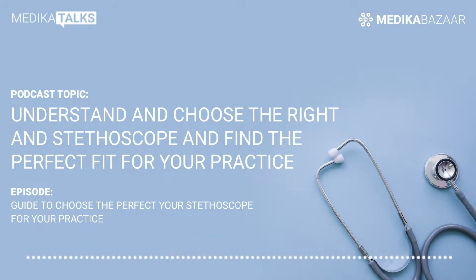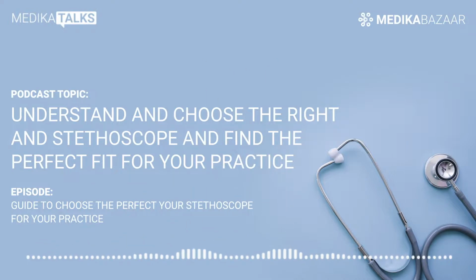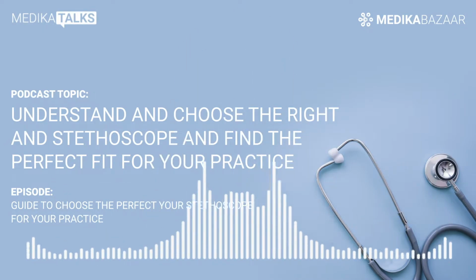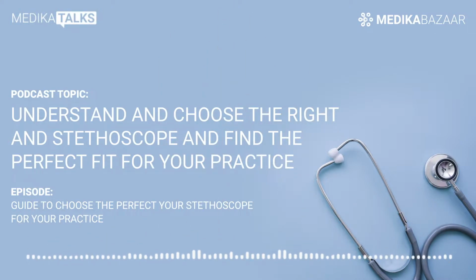It is placed against a patient's skin, and one or two tubes connect to two earpieces for the doctor or nurse. A stethoscope can be used to listen to sounds made by the heart, lungs or intestines, and even blood flow in arteries and veins. It is also used in tandem with a manual sphygmomanometer while measuring a patient's blood pressure.